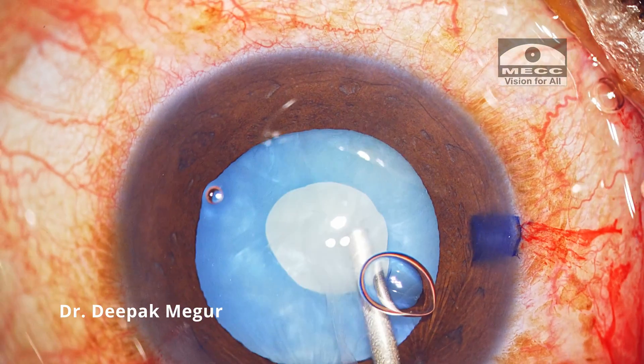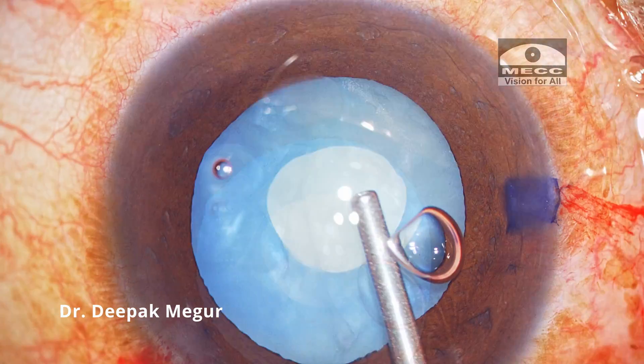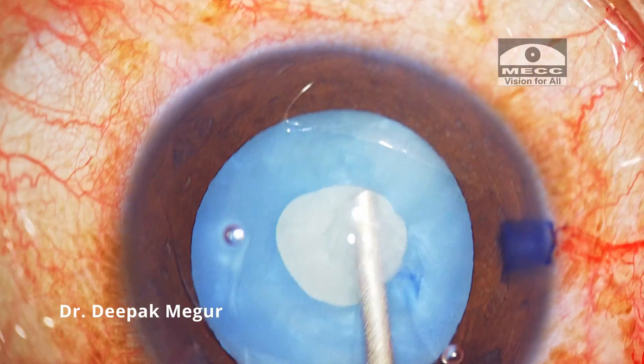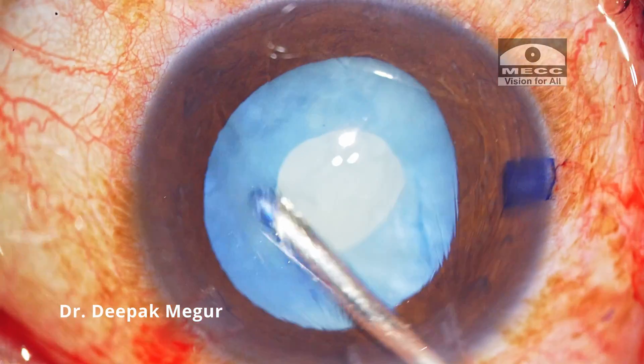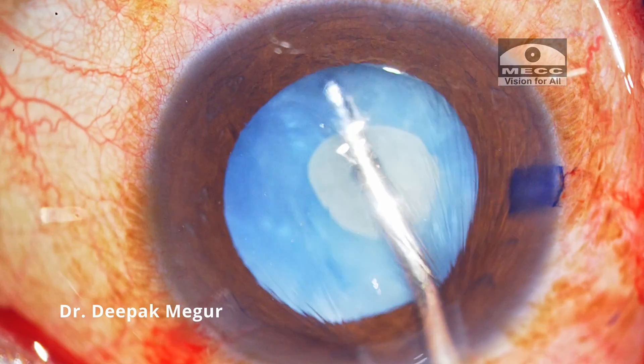Every time the chamber shallows, viscoelastic is injected to reform the chamber and aspiration is continued. It takes a few cycles of aspiration and refilling, and once the anterior cortex is removed, I now need to remove the swollen cortex which is posterior to the nucleus and not visible to us.